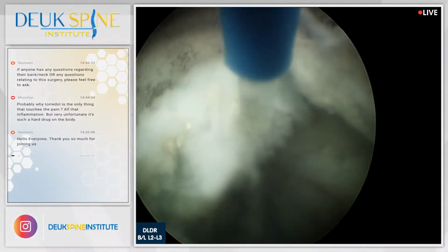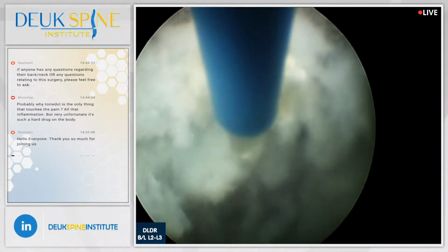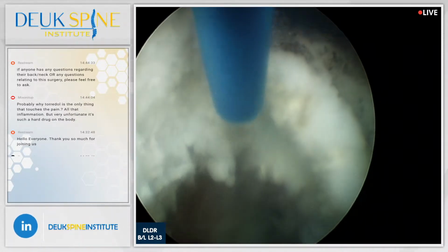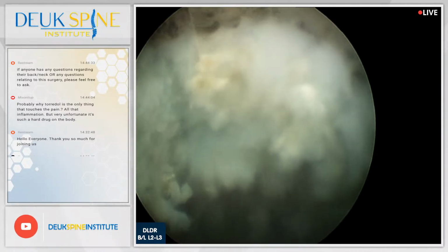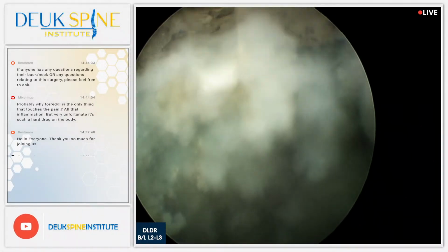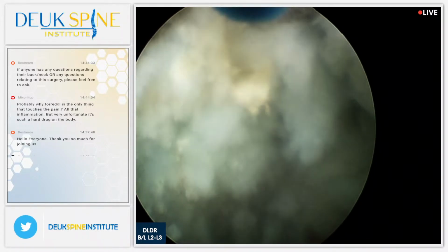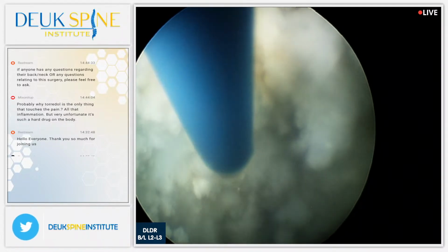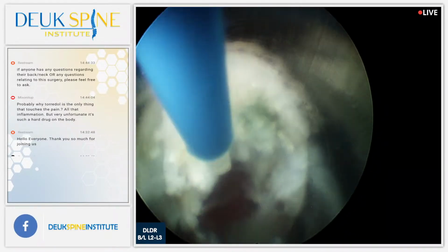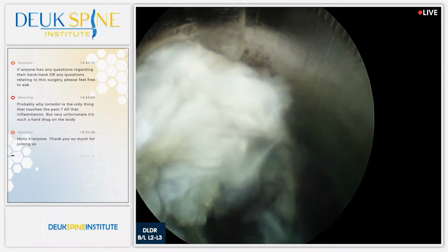It's been attacked, and as a result of the attacking by inflammation, it is what's called acidophilic, or acidic is an easier way. And that means that its pH or pKa of the proteins has been lowered down into the acidic side of the spectrum. Long story short, what does that mean? It means that it binds the dye, so it helps me see it.